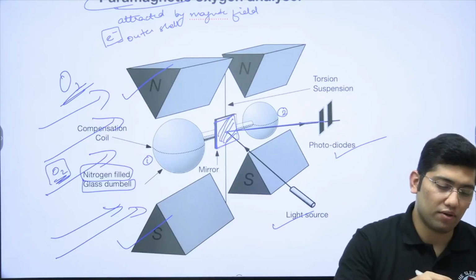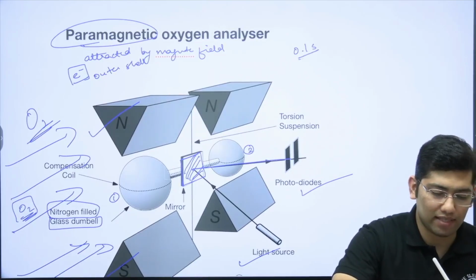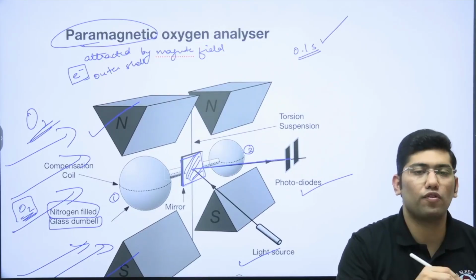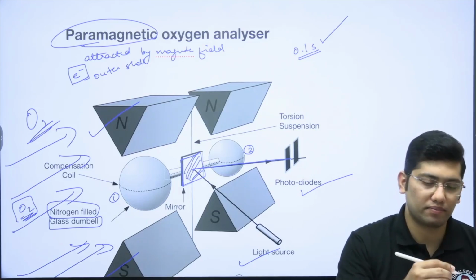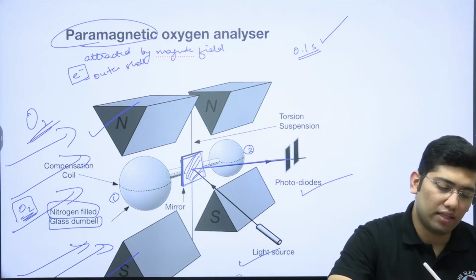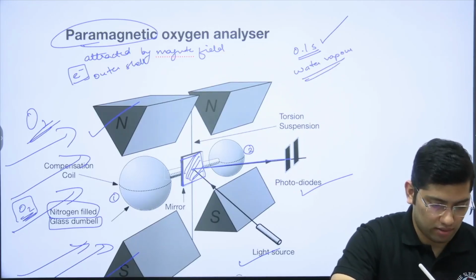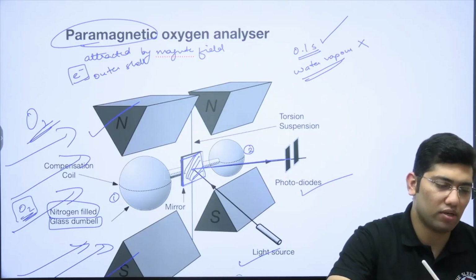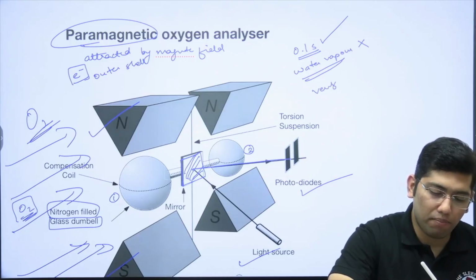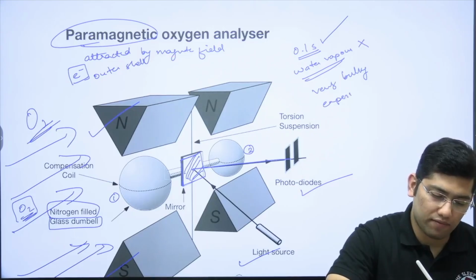All right. Now, the response time of this is 0.1 seconds. It's very useful in rapid breath-to-breath analysis. Now, the disadvantage with it is water vapor tends to contaminate this and causes inaccuracies. Also, it is very bulky and expensive.